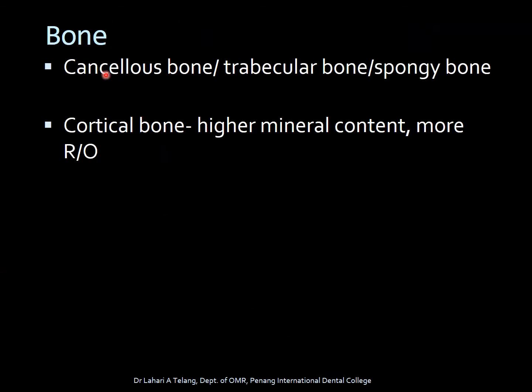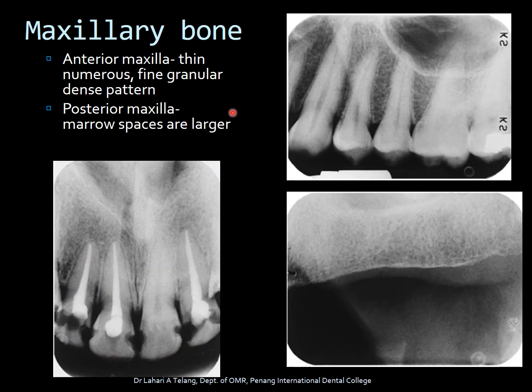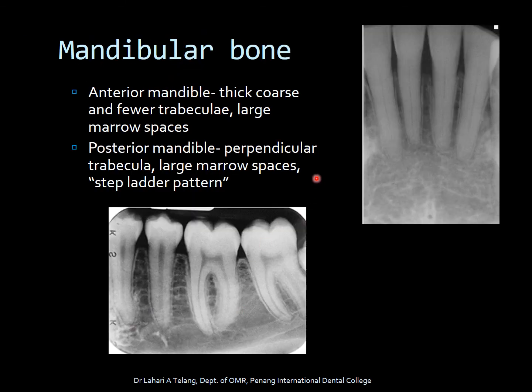Bone consists of cancellous bone — also called trabecular or spongy bone — and cortical bone, which has high mineral content and appears denser and more radiopaque. In the anterior maxilla, there is a thin, numerous, fine, granular, dense pattern of trabeculae, whereas in the posterior maxilla the marrow spaces could be slightly wider. In the mandible, the anterior region generally has thick, coarse, and fewer trabeculae with larger marrow spaces. The posterior mandible shows perpendicular trabeculae in large marrow spaces — this pattern of perpendicular lines is called the step-ladder pattern of trabeculae.